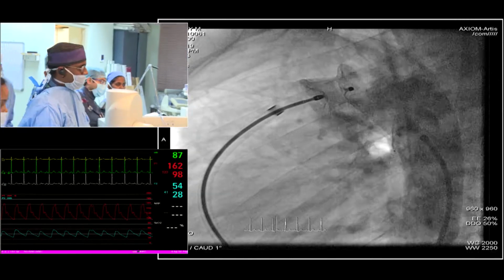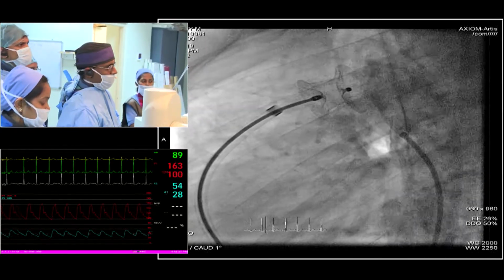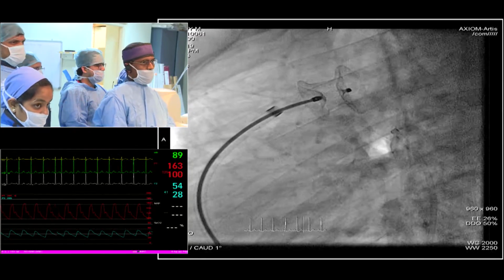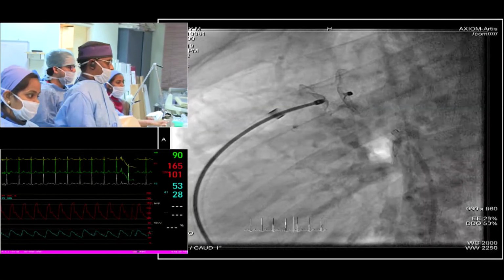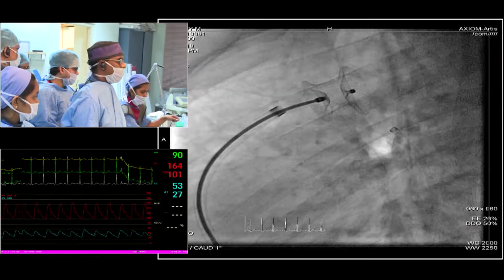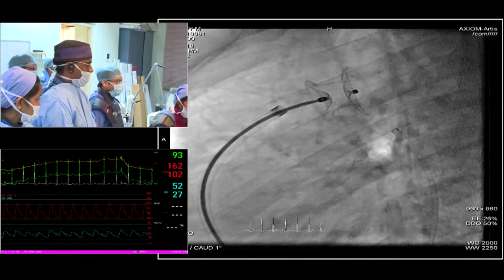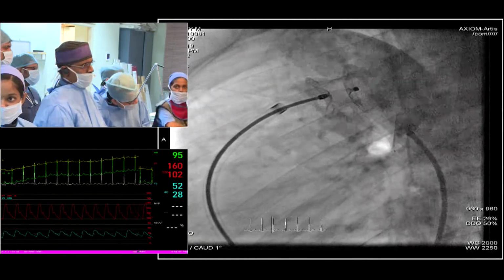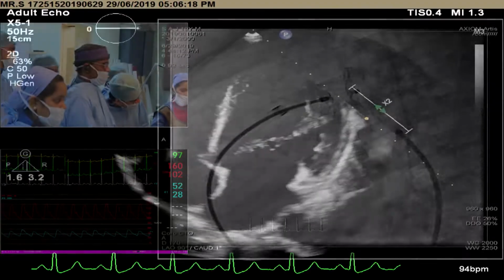Come closer. Help him out. Come to the apical four chamber view. You could, I suppose, make the argument that some residual flow at the moment might allow some time for the physiology to adapt. I don't know whether I believe this. Give him Milrinone because he has a high afterload now by closing the duct, I guess.